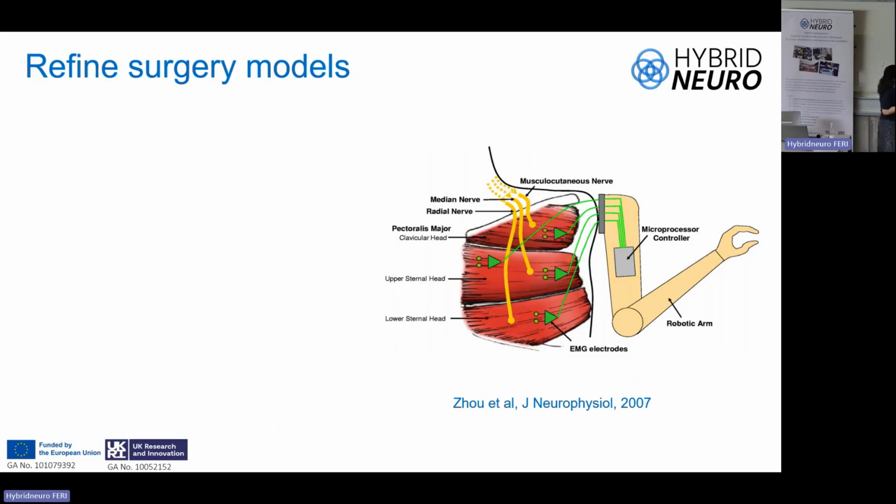So the idea was this brilliant, really genial idea from Chicago. Our upper limb is controlled by three nerves. So we could split the pectoralis muscle in three portions, and reinnervate each of these portions with one of the nerves that innervates the upper limb. And what happens is that the nerve reinnervates the muscle, which acts as a biological amplifier, and now you have three independent sites of control that you can use to control different functions of the prosthesis.